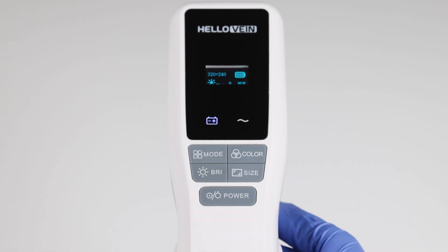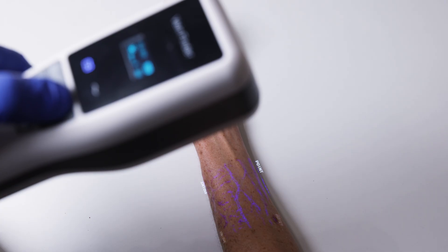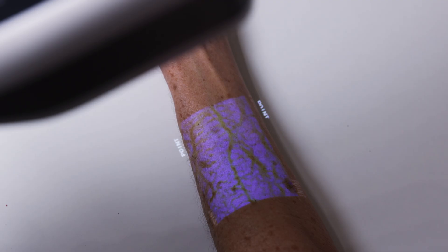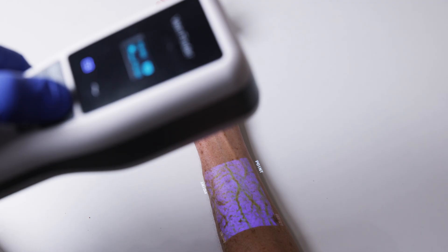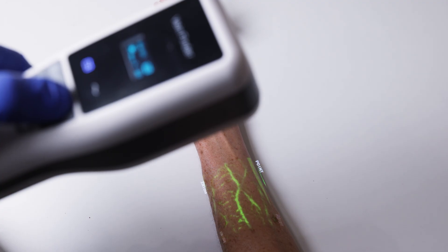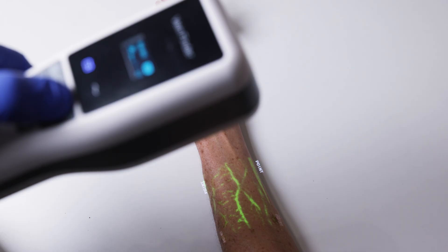The color setting features six different colors: red, blue, blue background, gray white, green, and green background.